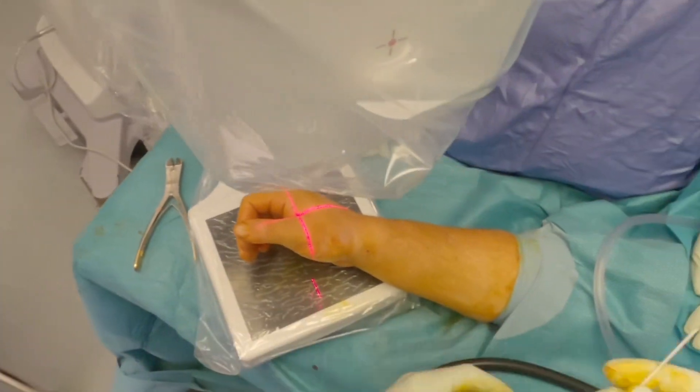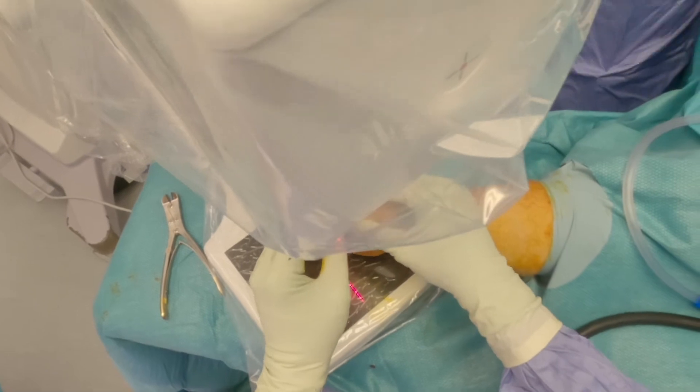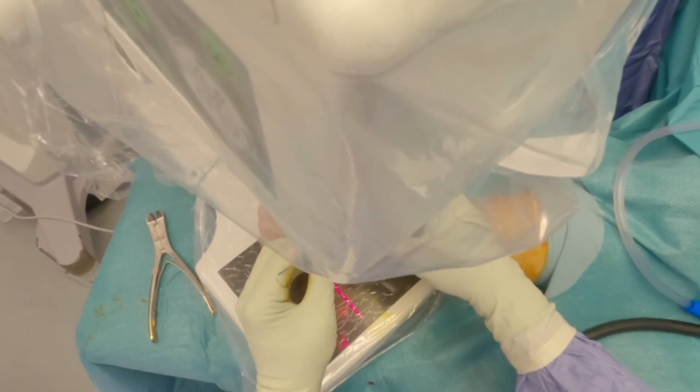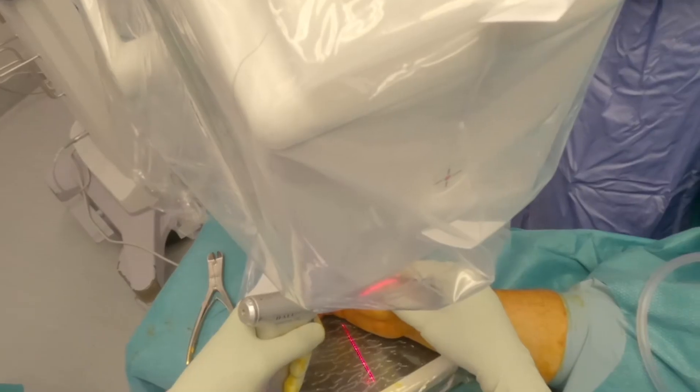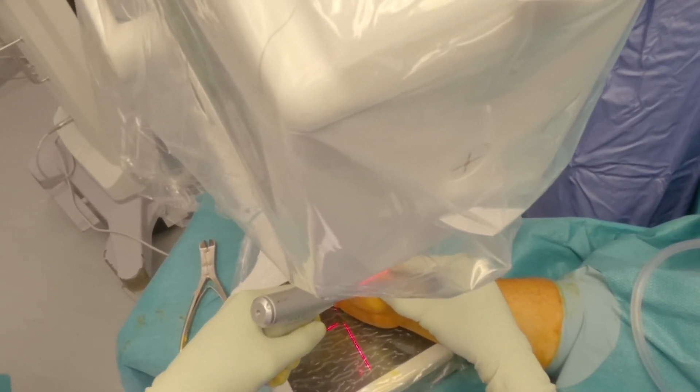I do not use a transverse wire, and more often than not I only use a single oblique wire. In this case I used two oblique wires because the first wire captured the beak fragment and an additional wire was needed to stabilize the joint.